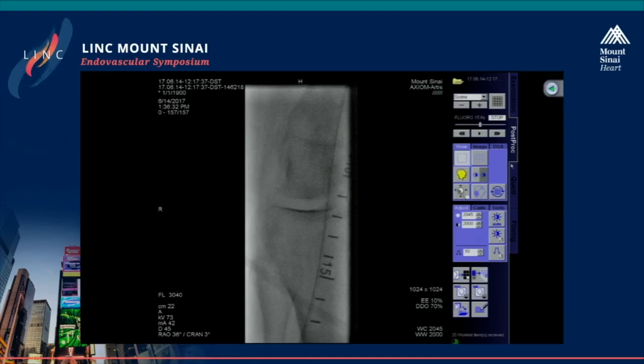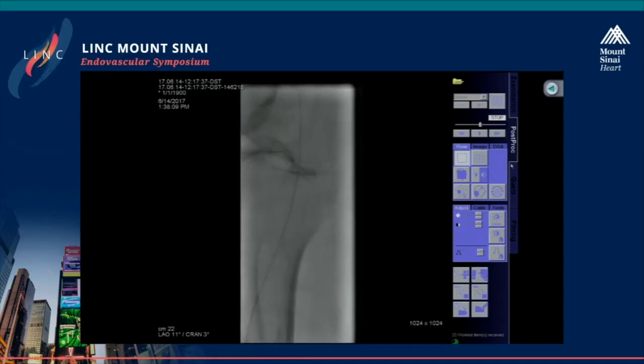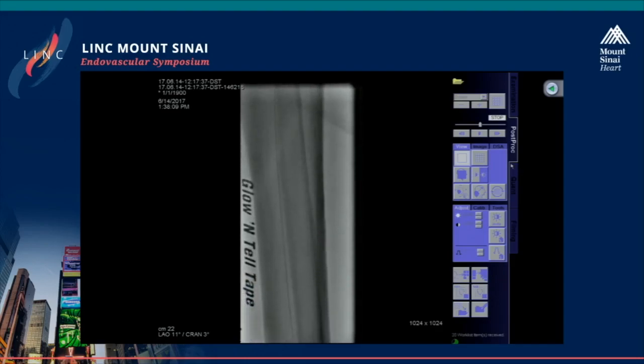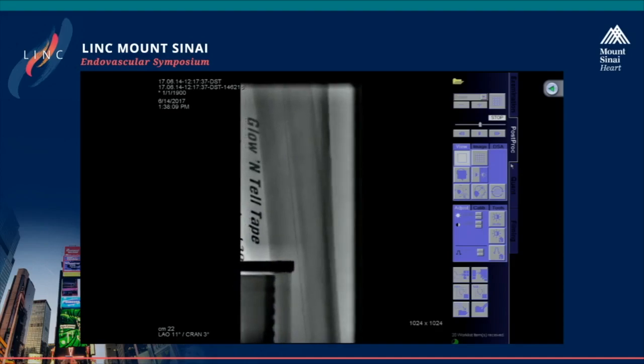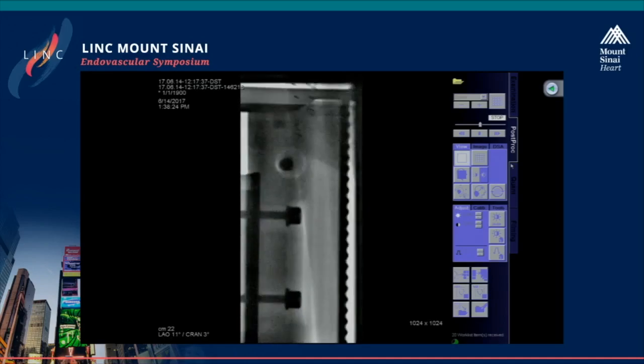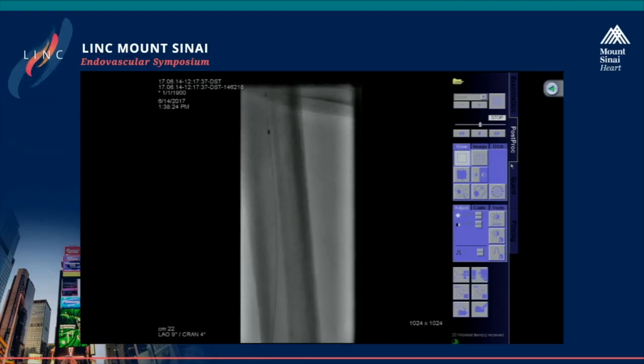And you don't have this with atherectomy? It's unknown. At least we have one potential solution to overcome also the limitation of DCB. I will show you during my talk that there are some studies ongoing evaluating the combination of atherectomy plus DCB. That would be one way to go in this long lesion, because the other solution, implanting multiple DES, is not the best one, because we are dealing with a very long lesion.